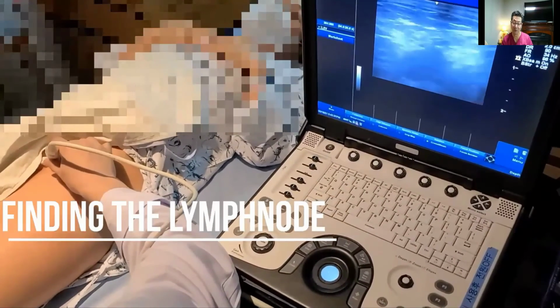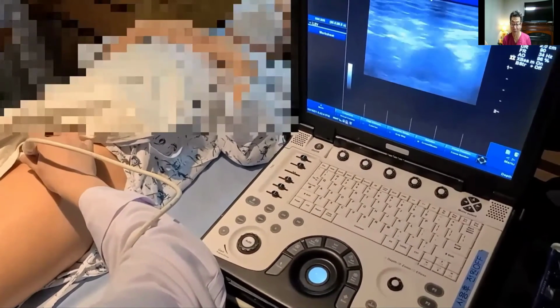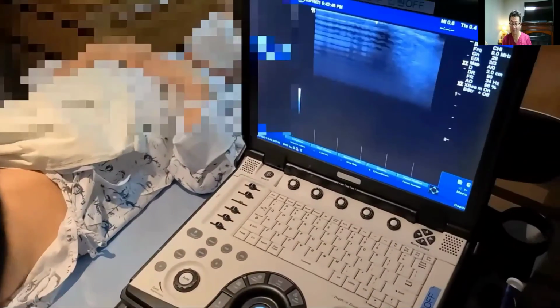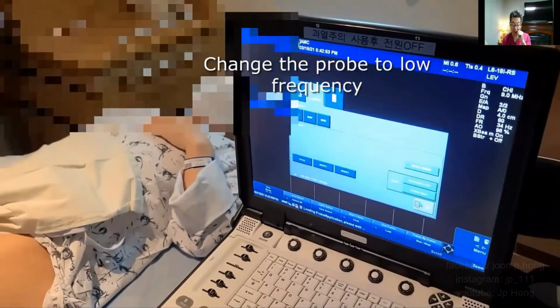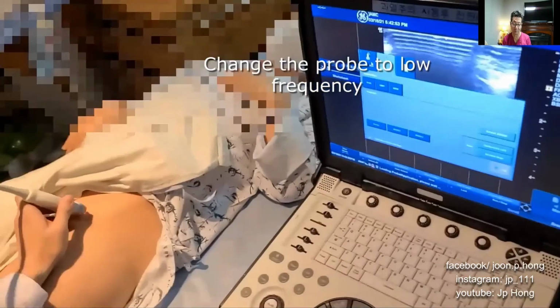The next part is that we like to use the ultrasound to map out the lymph node as well. Our recent publication shows that if you're able to identify functioning lymph nodes, connecting the lymph node to the vein will allow drainage from the lymph node to the vein, and this helps the release of the upper thigh and the pubic region.